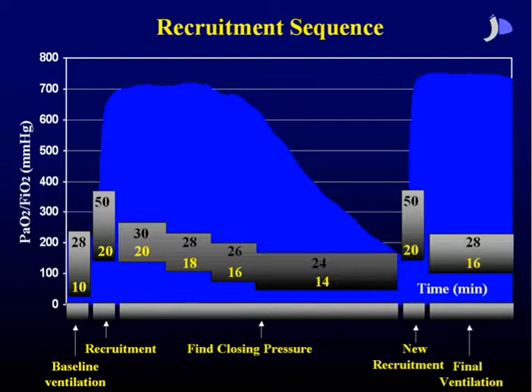But you have to realize that online blood gas monitoring is probably not available to any of us. So specifically, when studying the lung tool, we wanted to look at mechanics. This particular patient was also studied with the lung tool, where we could follow online, on a breath-to-breath basis, the evolution of dynamic compliance. And it looked like this.